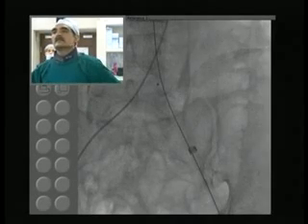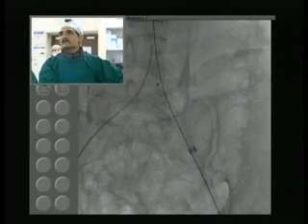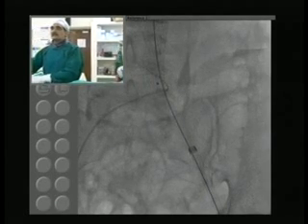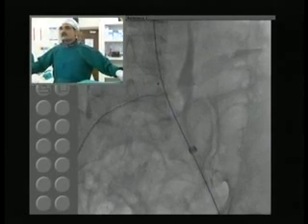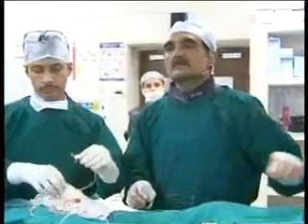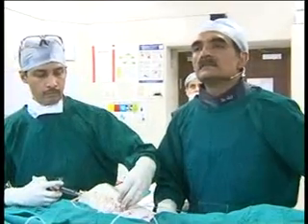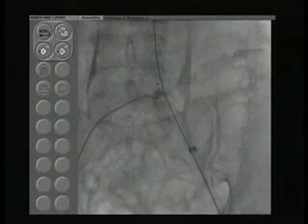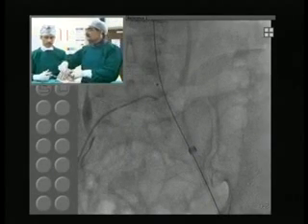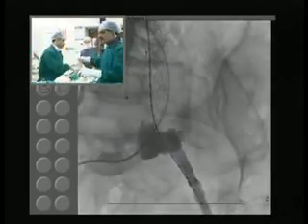So maybe what I can do is to pull this renal catheter out and make it look down this side so that we can that way be able to see this side. Okay. Test that. Okay. Maybe we need to go down properly. So we'll take the Terumo wire and pass it down. Wet it, please.